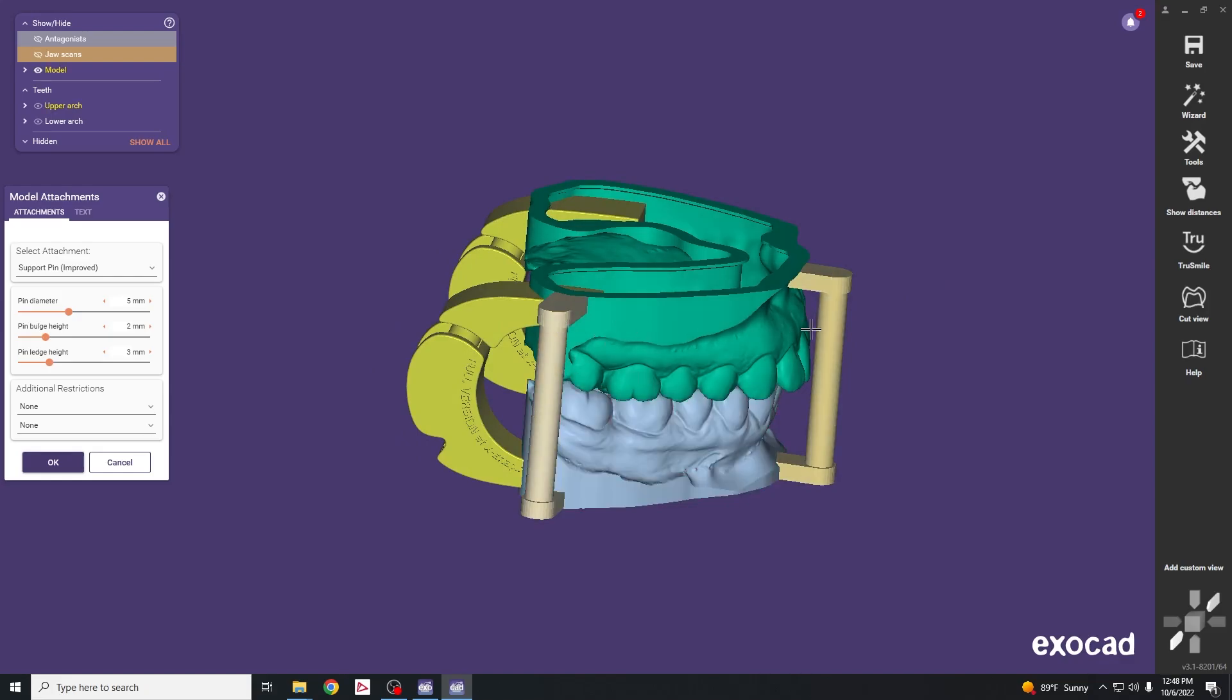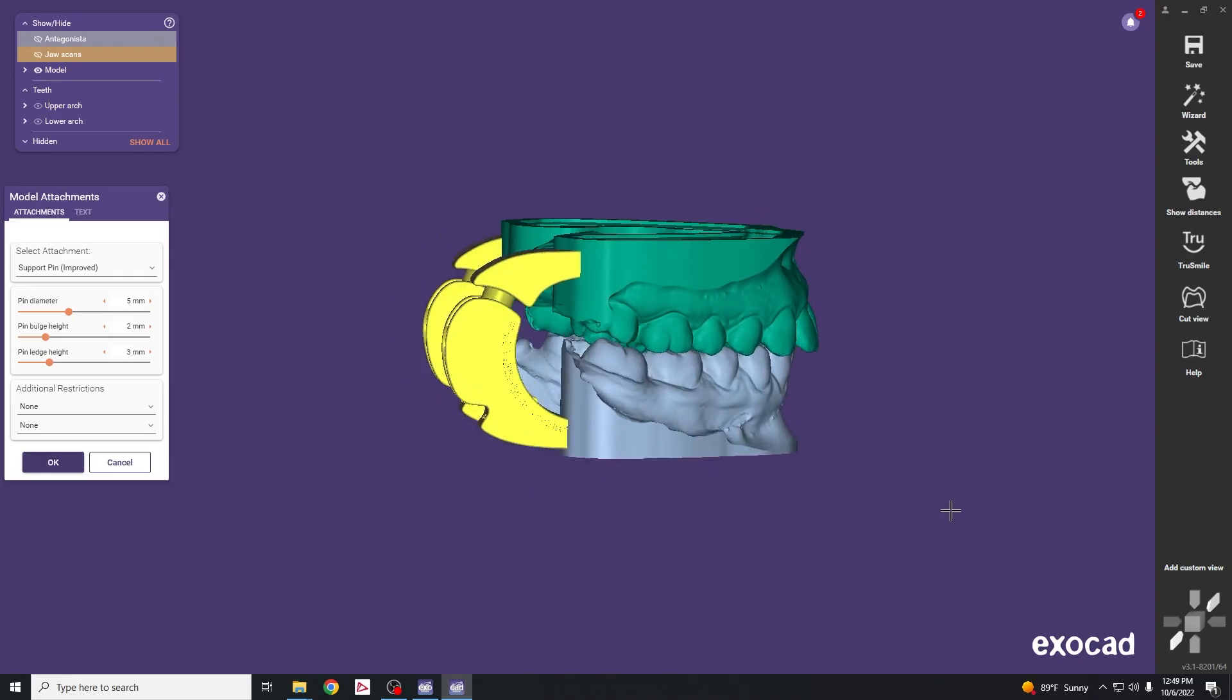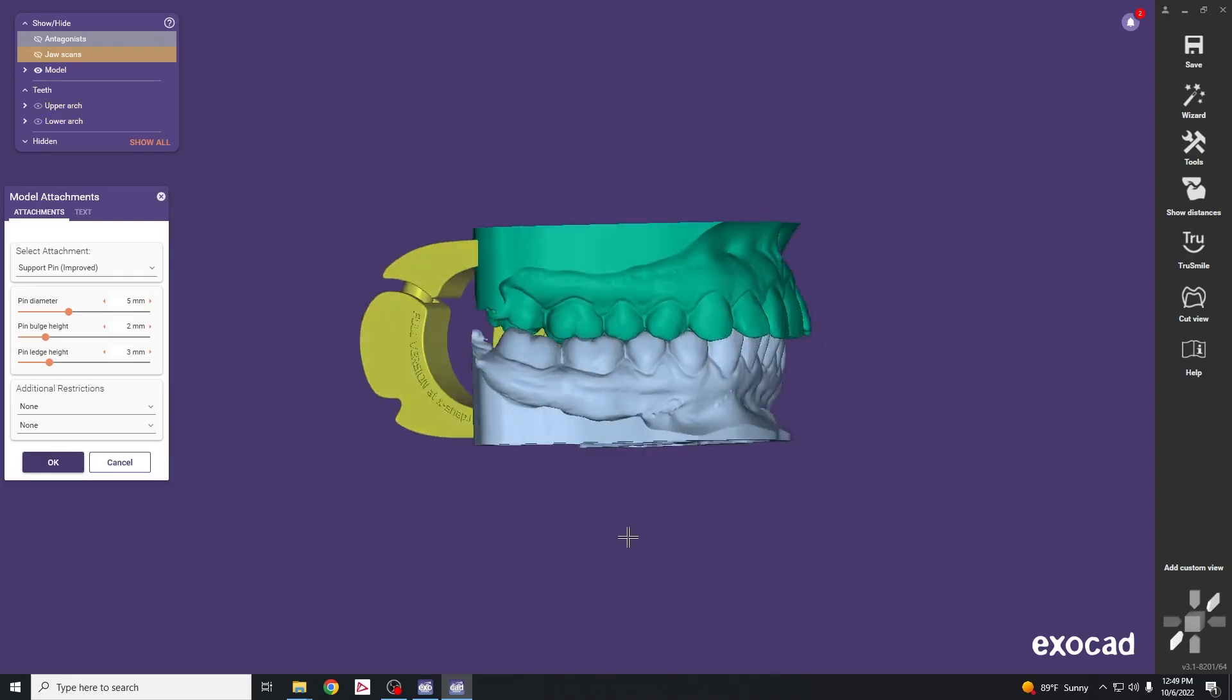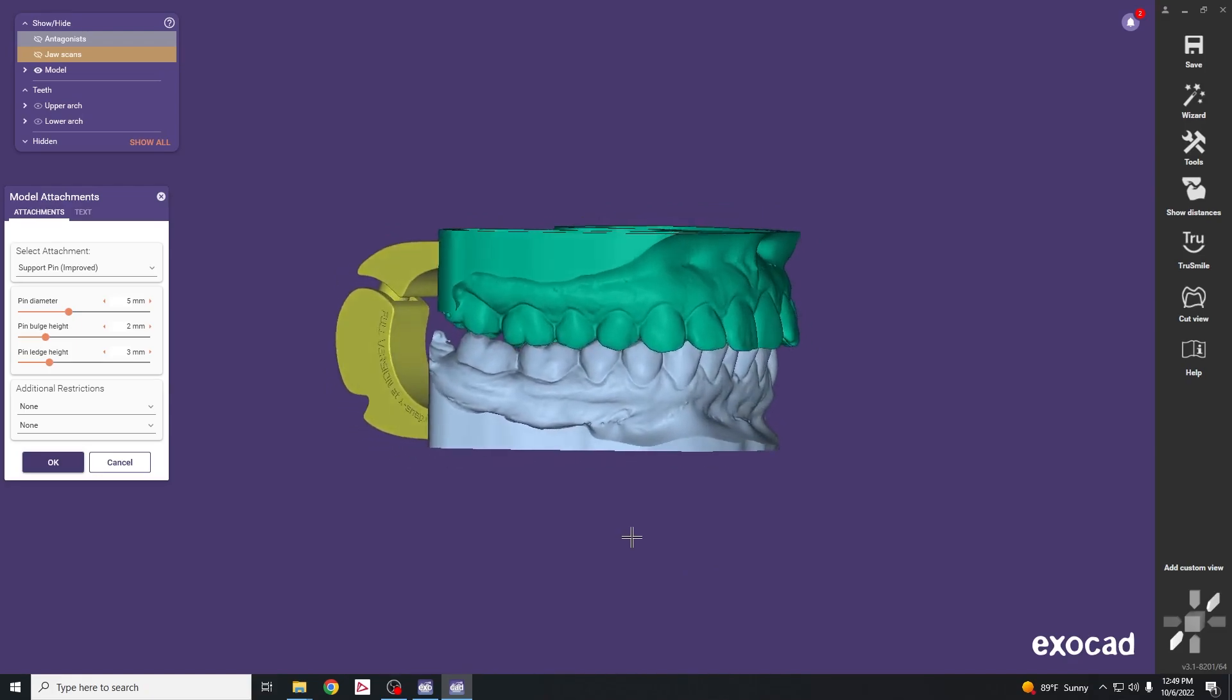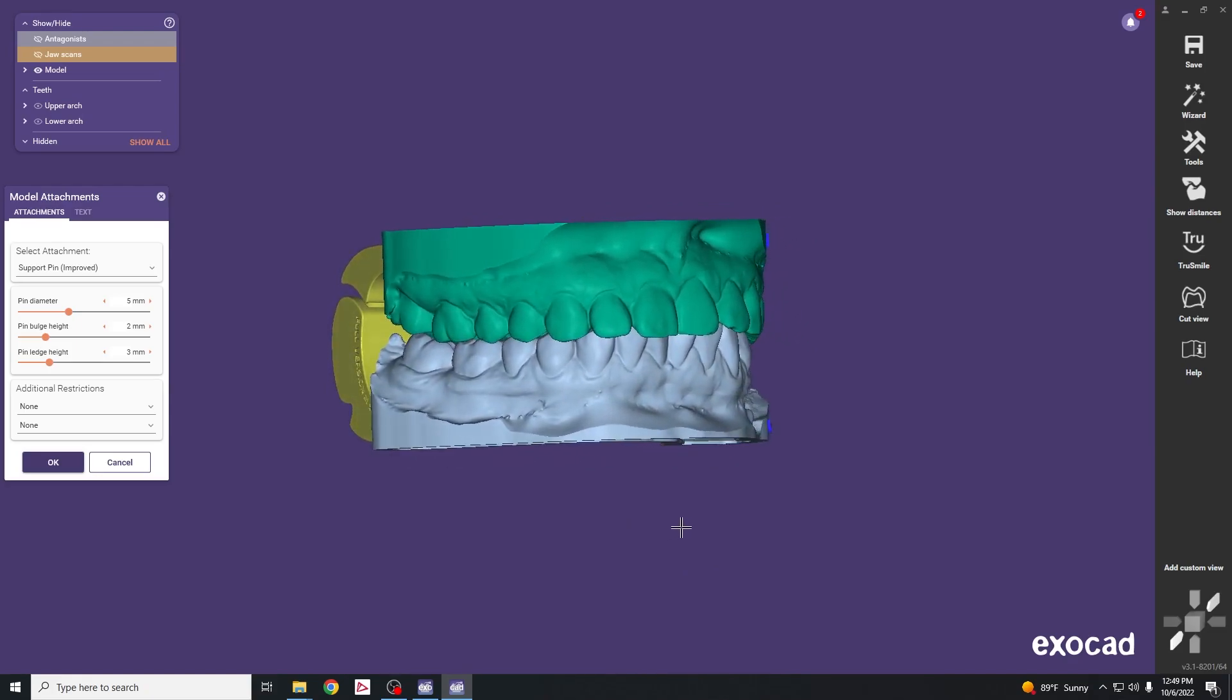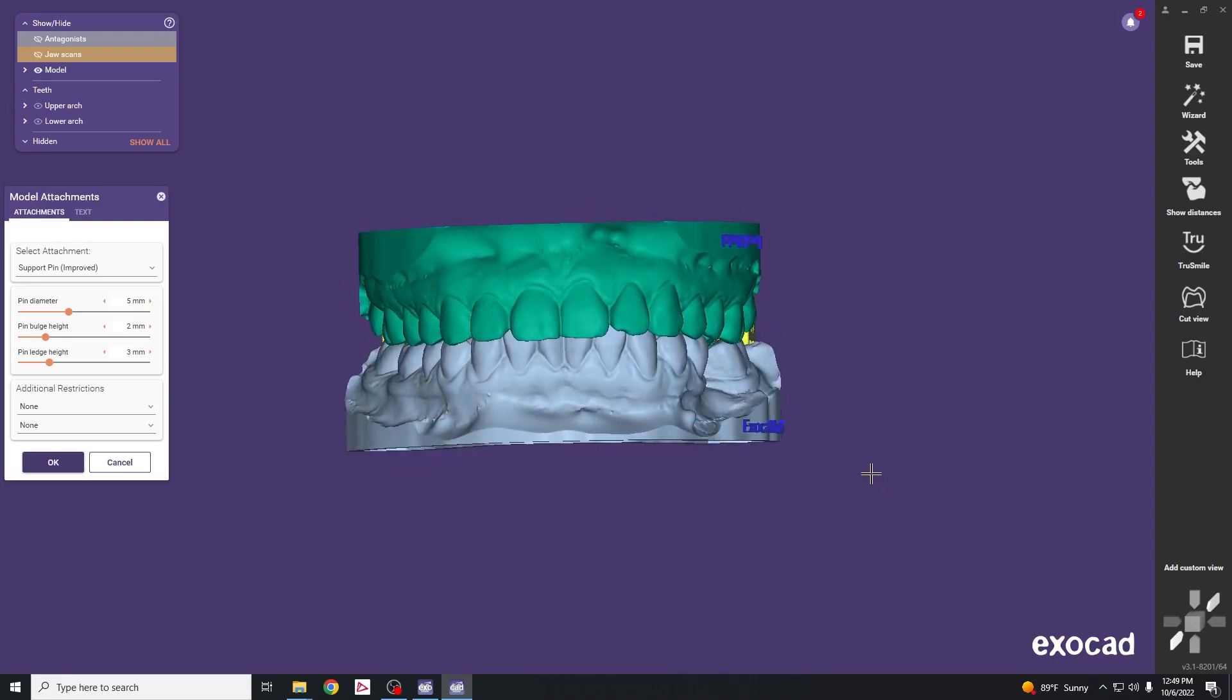If you're doing basic treatment planning where you're not mounting it on a semi adjustable articulator, it's acceptable to add the X-Snap features because this allows you to have a hinge where you can open and close and do some minor excursive movements.